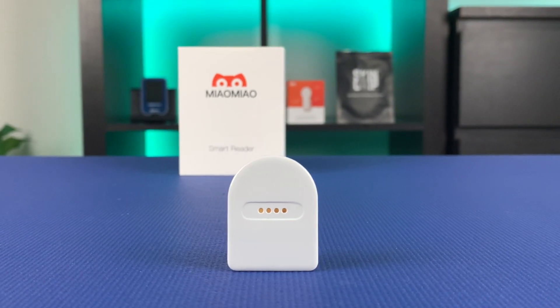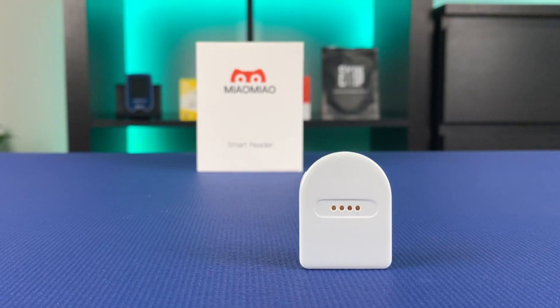This is the first generation of Meow Meow — the cheapest way to turn your Freestyle Libre 1 or Freestyle Libre 2 sensor into a CGM. So if you are tired of scanning your sensor, if you want your blood sugar readings sent directly to your phone, plus get alarms when your blood sugars spike or drop, and if you don't want to spend too much for it, then keep watching.